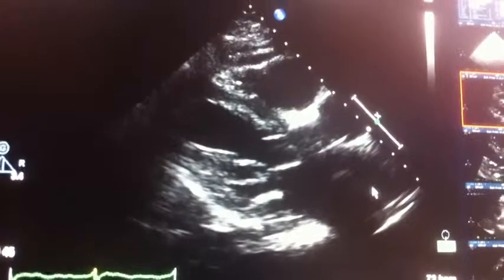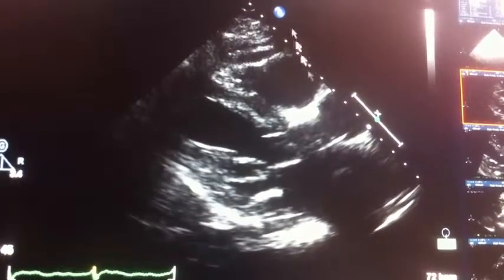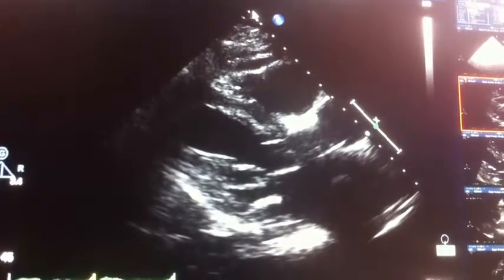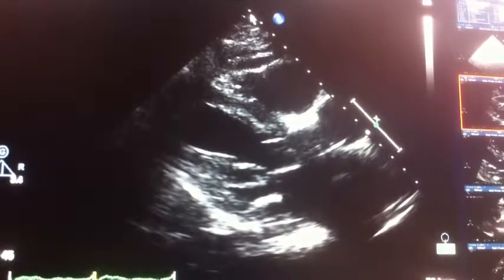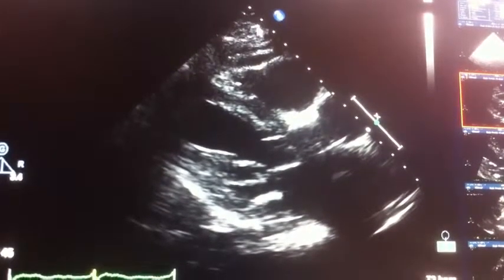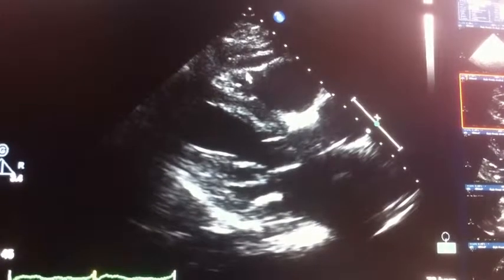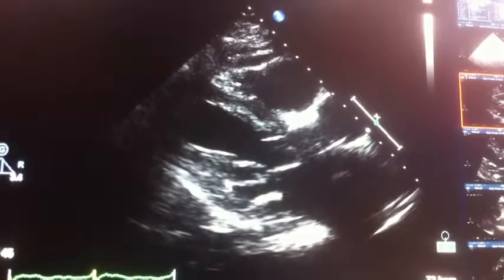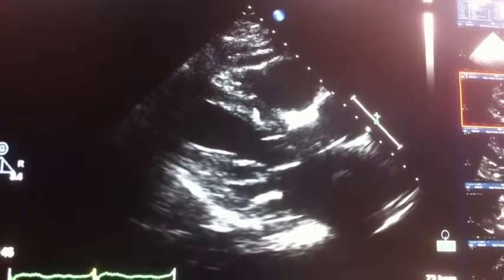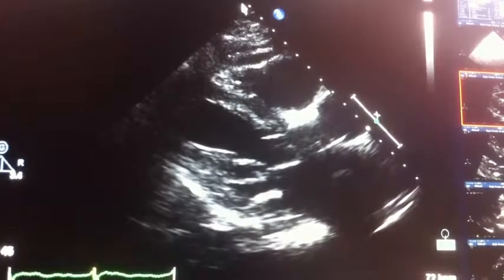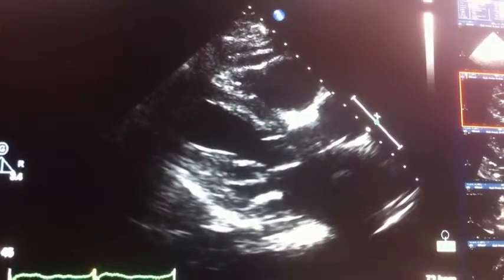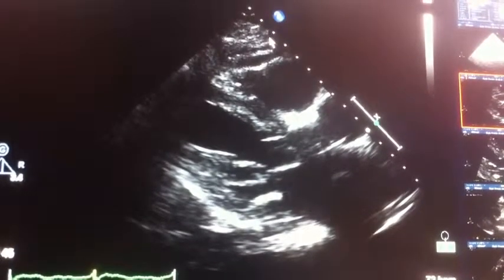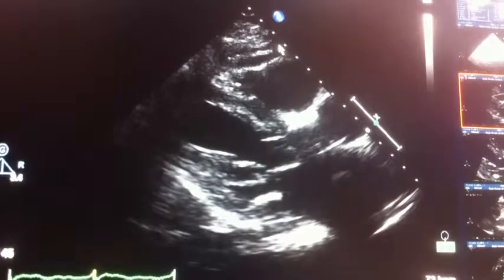Just to orient you, this is the top of the screen where the transducer is, and this is deeper into the body — just like sonar. We send sound waves down into the body, they hit things and come back up to the transducer up here. And these are centimeter markers; every two and a half of these or so is about an inch.